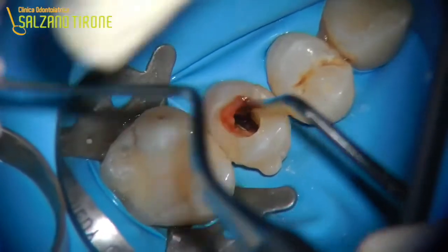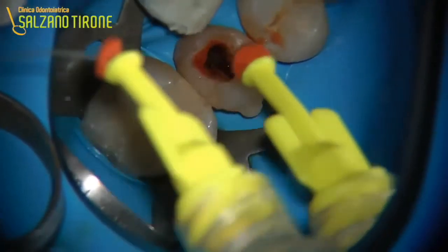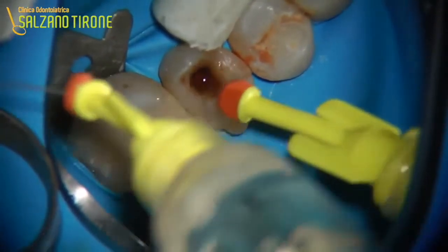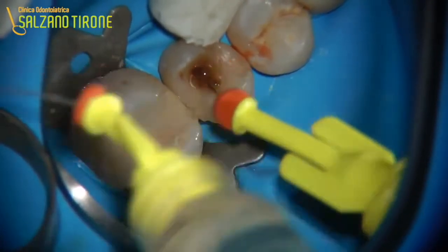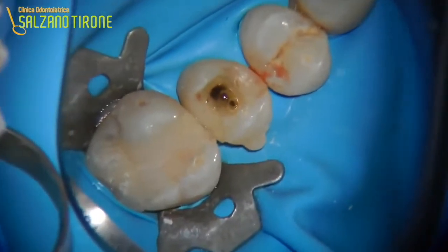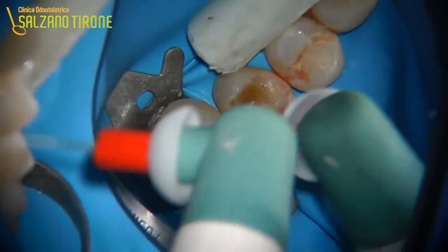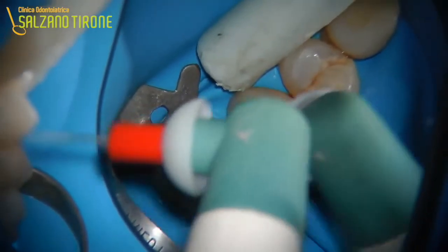From here, getting to that area is absolutely not complicated, nor far, nor unreachable with a microscope. The first phases of this kind of intervention are always a little hectic, because even if you were expecting to find some bleeding tissue, when you get there it's a big mess. Everything starts bleeding, you feel frustrated because you think you are dealing with an impossible to recuperate tooth, you scratch here, rub there, even what you thought could never bleed starts bleeding instead. Overall, the whole experience is somewhat traumatizing since you witness bleeding in a part of tooth which isn't supposed to bleed at all.